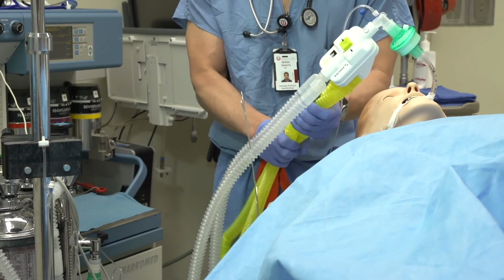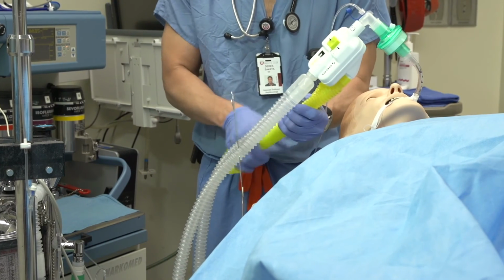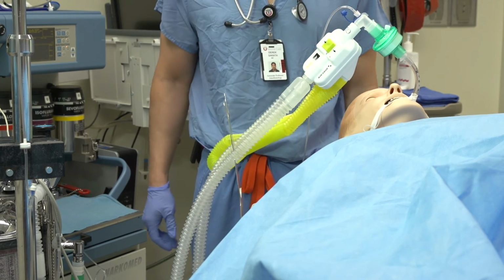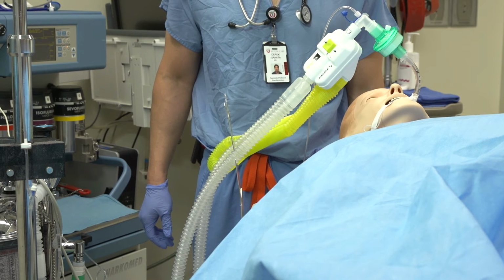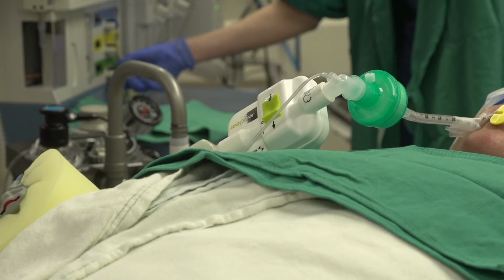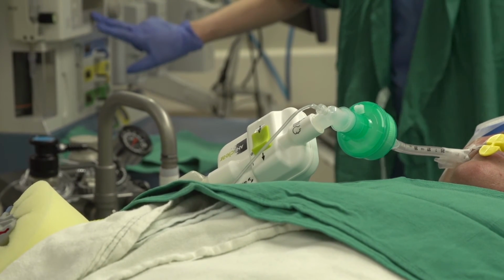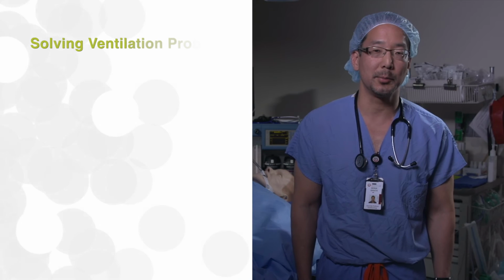If the patient's calculated maximum tidal volume is less than 700 to 800 milliliters due to patient size, physiology, or pathophysiology, the rebreathing hose can be decreased accordingly. Tailoring the amount of rebreathing for each individual patient can be done by setting an appropriate tidal volume and then adjusting the rebreathing dead space such that the fraction of end-tidal carbon dioxide remains in the range of 50 to 60 millimeters of mercury.